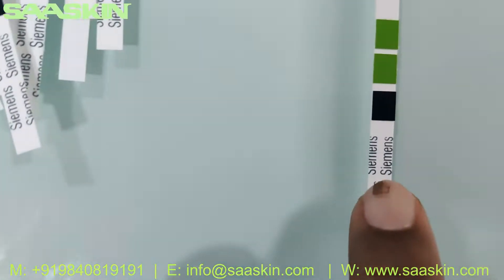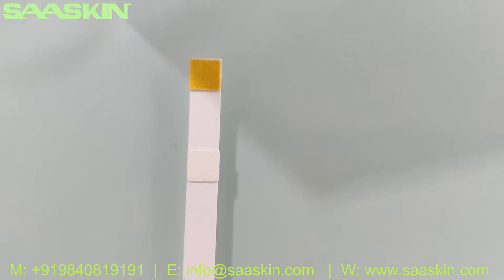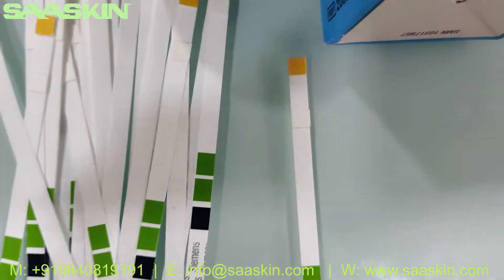If you want to see one strip more clearly, I can show you. You can see the bands — it is for albumin and creatinine.